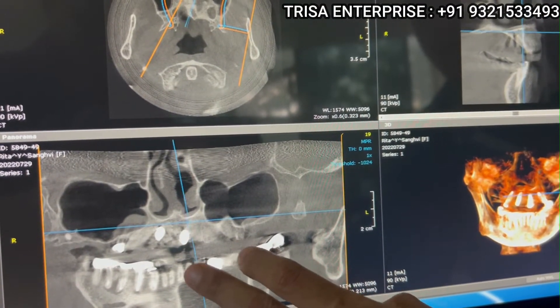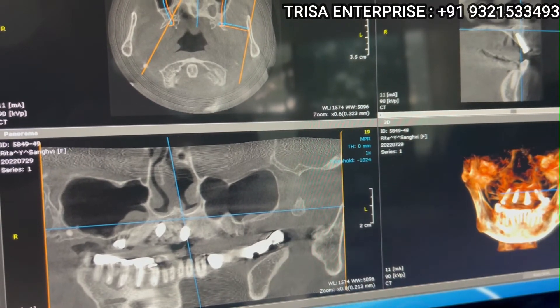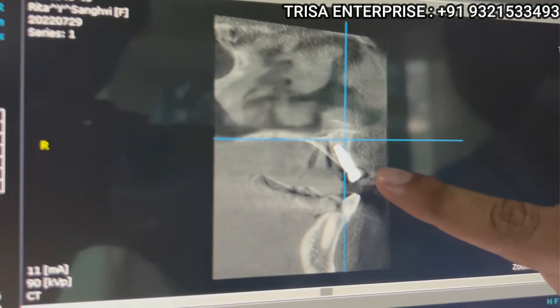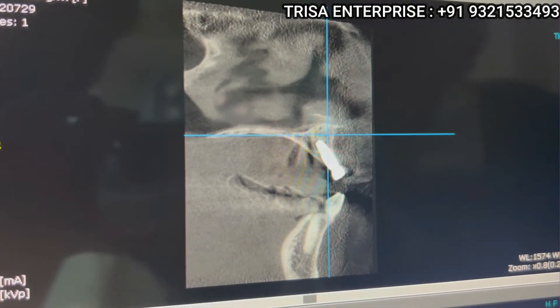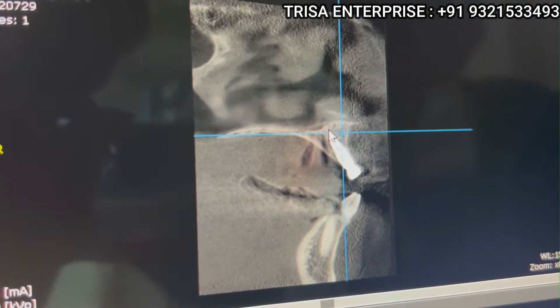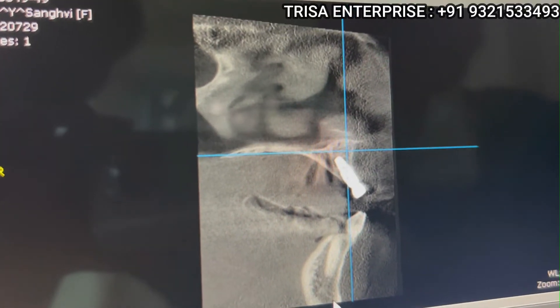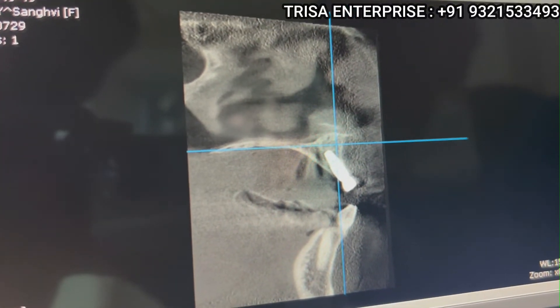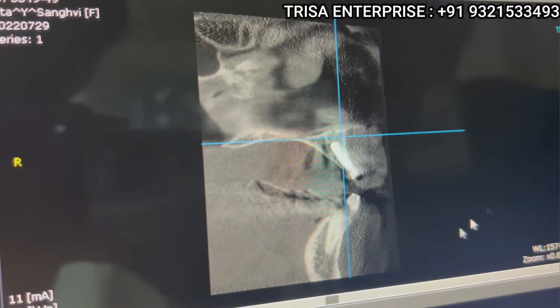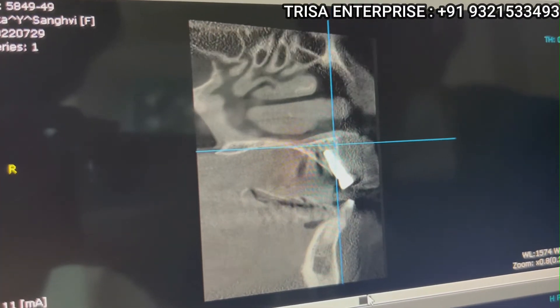I can change the tilt of the implant to match how it sits in the mouth. Now you see this image — there is ample labial bone, ample nasal cortical bone, and ample bone overall. See what happens as I move the cursor — the picture changes completely.